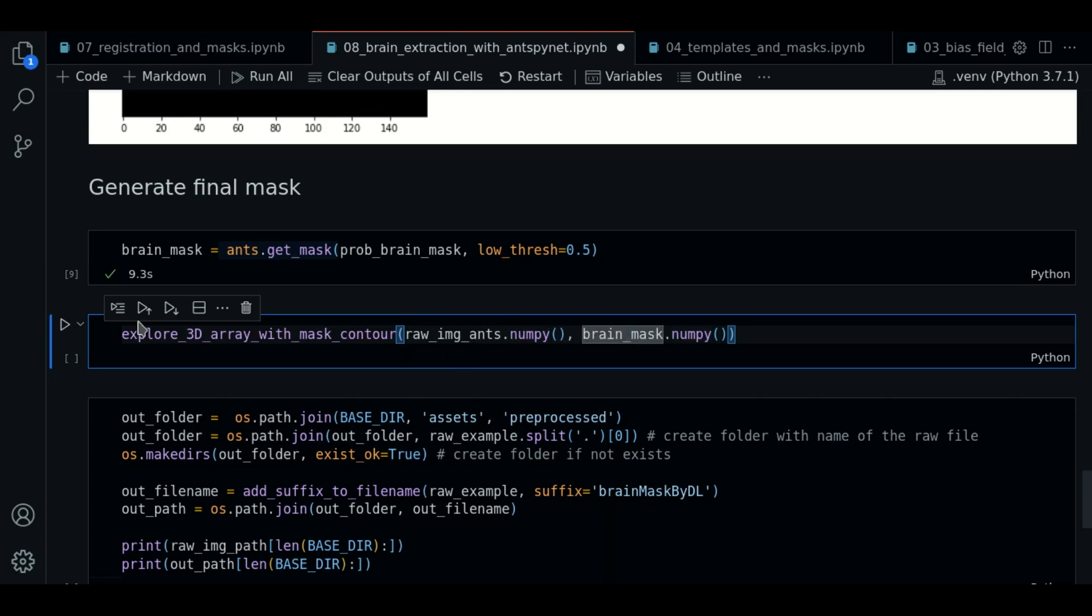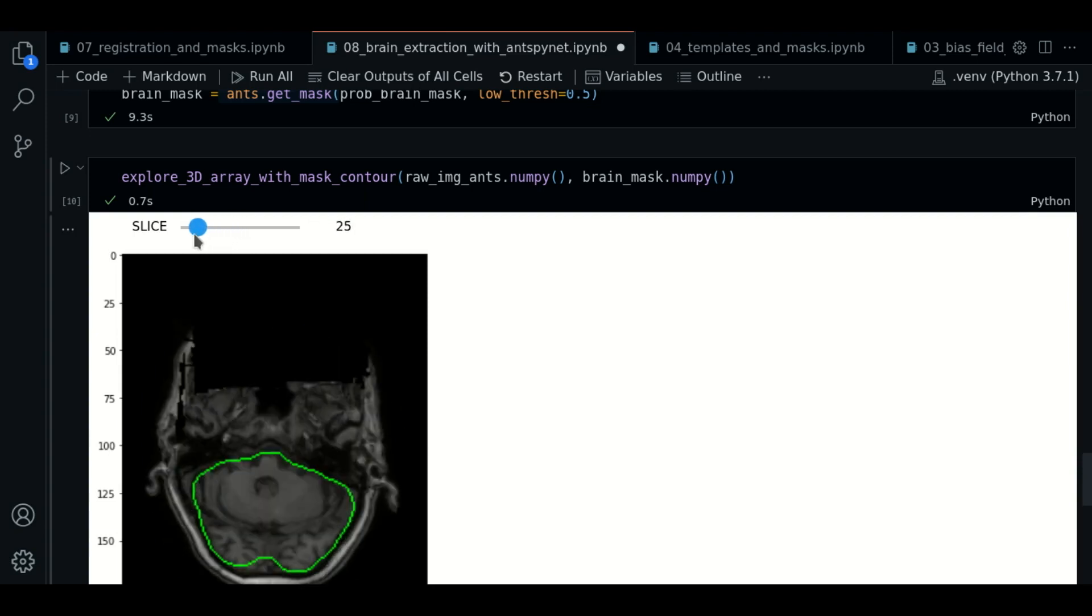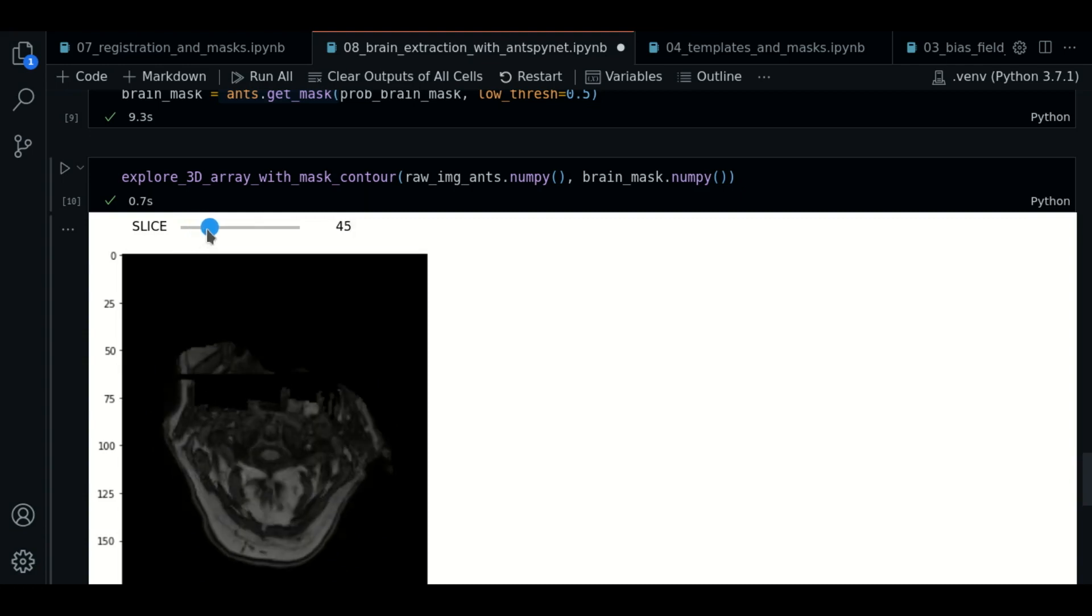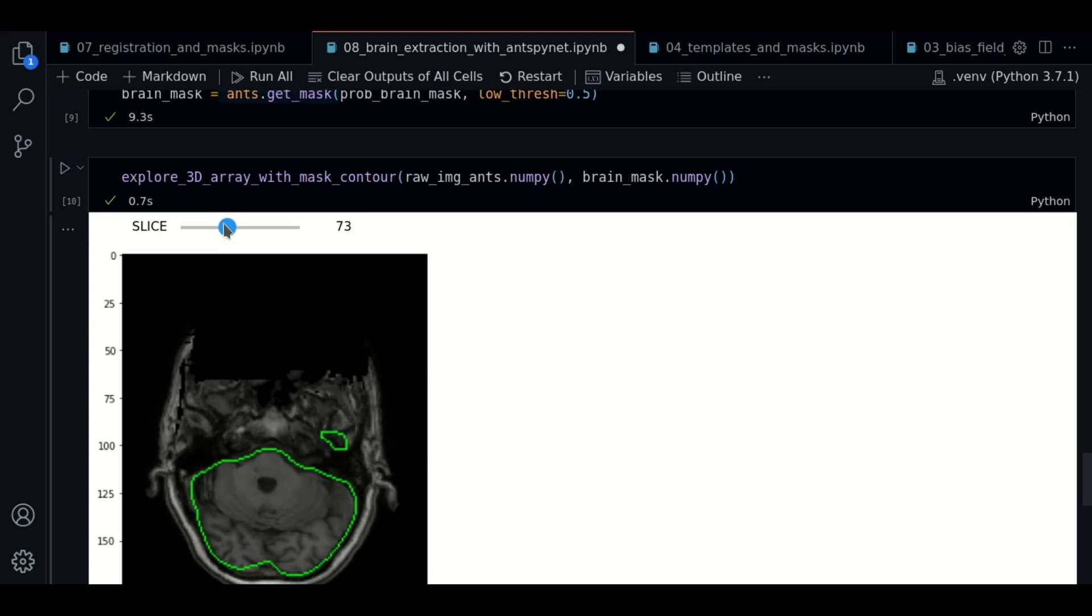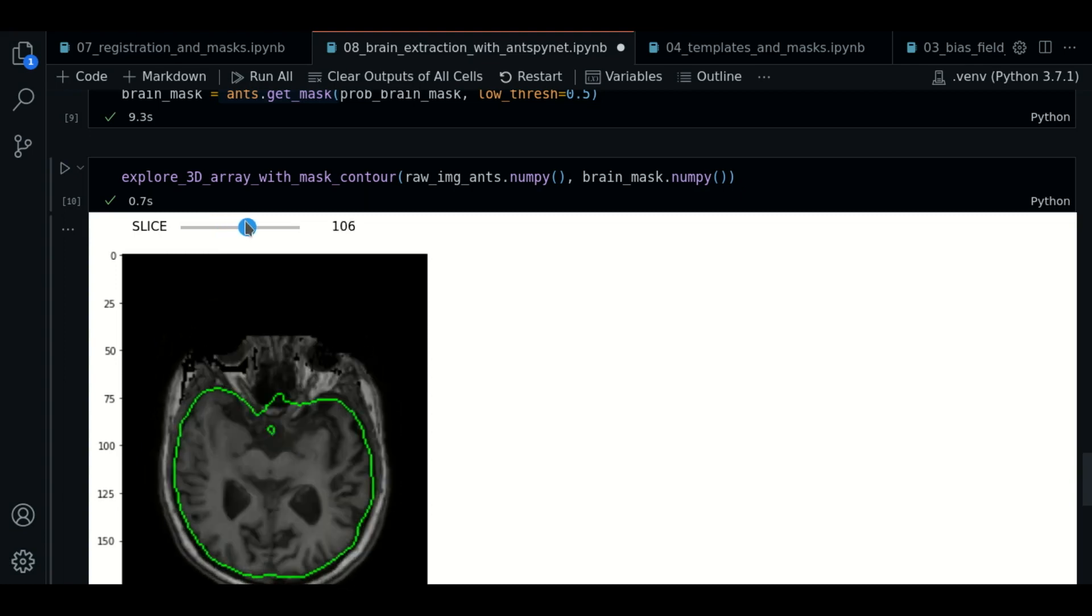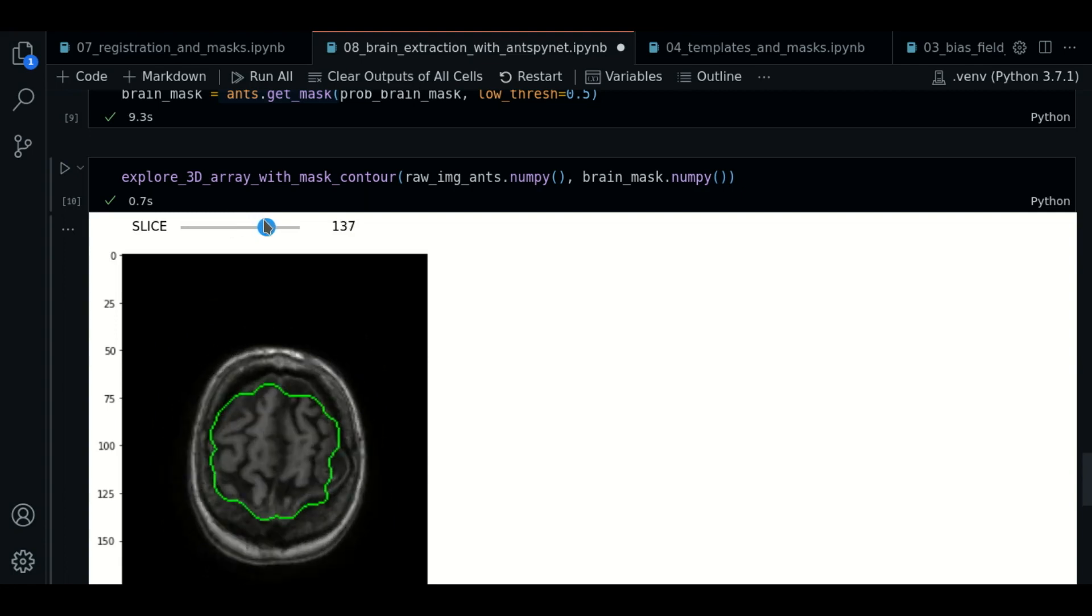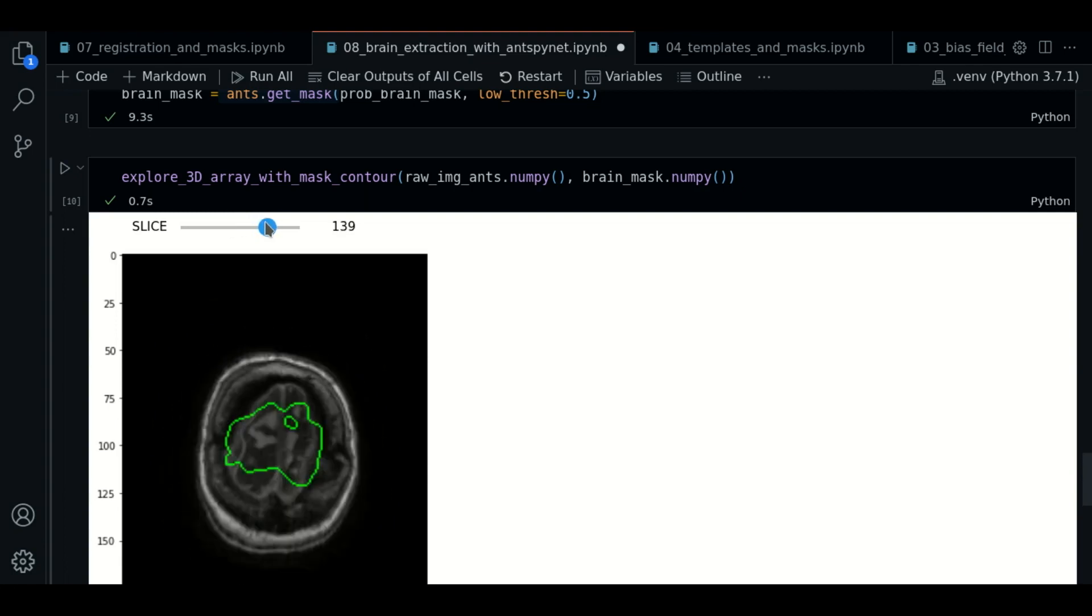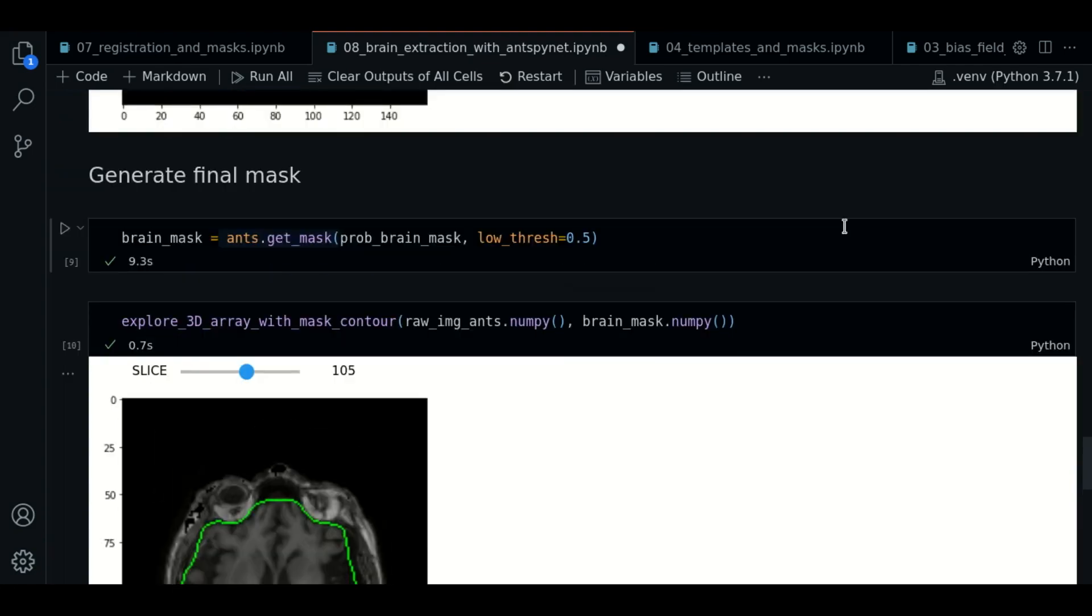So we're going to explore the result as a contour. And now let's explore the results. As you can see, we have the mask that was generated, and it delineates the brain region pretty well actually.